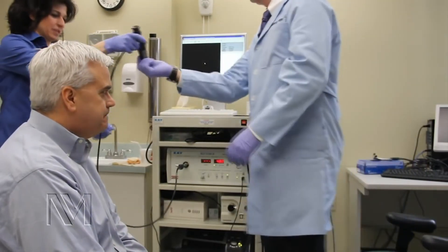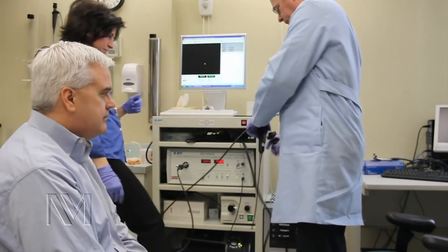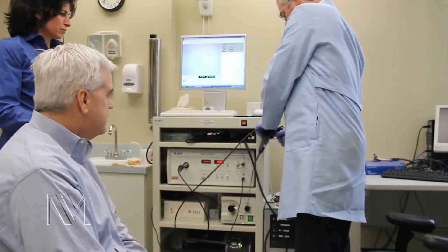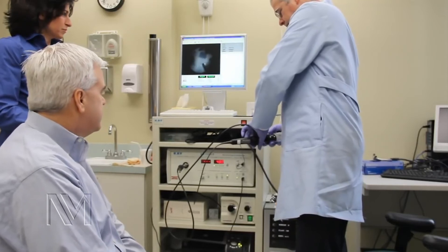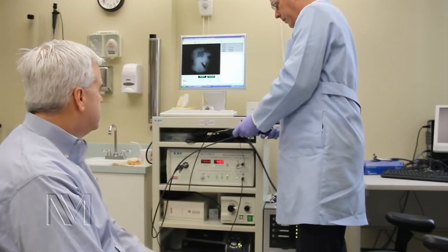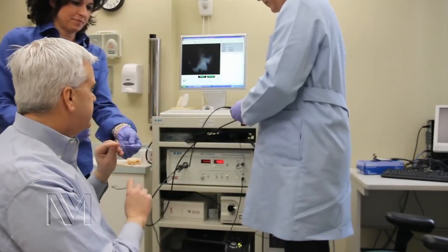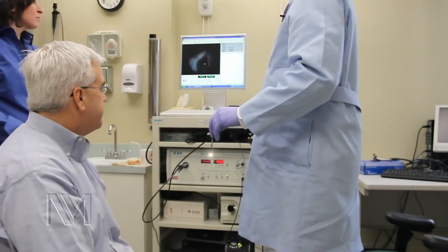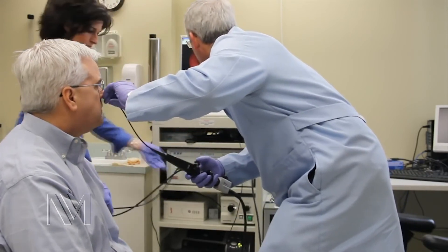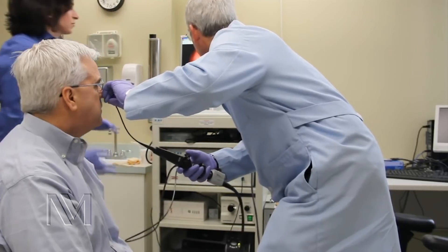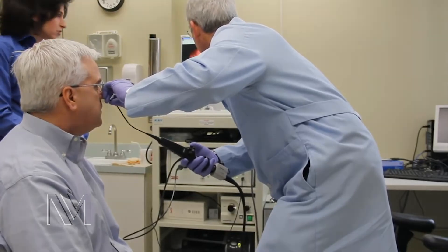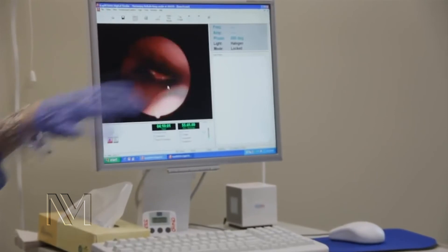So we're just putting the camera components together here and you'll be able to see your sinuses. We're going to go in through your nose here — going in through the nose — and work our way right down through there. A little bit of a push here. John, you're doing a great job. Your airway looks open and good.